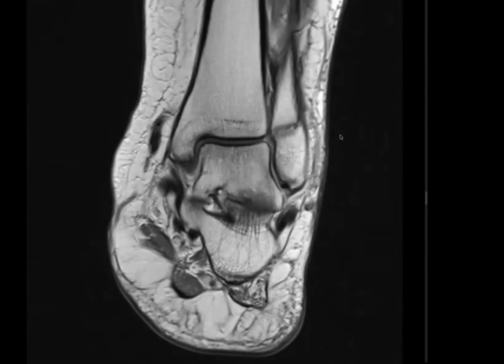So correlating all my findings, this looks to me like a case of a bony injury involving the lateral malleolus of the fibula with associated ligamentous injury in the form of anterior talofibular ligament avulsion with associated subcutaneous edema. In my routine practice, I would refer this patient urgently to the orthopedic surgeon for management of the fracture and ligamentous injury. This patient may need immobilization and follow-up imaging for his treatment.